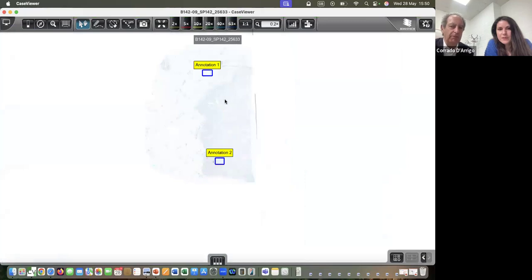You will need to spend a little bit more time. We have 10 more minutes. We can see another couple of cases. Okay.